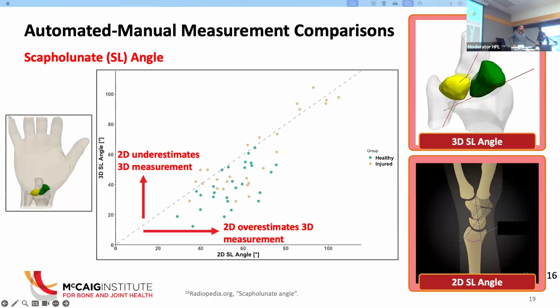So why would you validate in the cadaver model first and then move into this? I personally didn't do it, but there have been tests that have validated the contact area measurements between cadaveric and in vivo, whether in flexion extension or otherwise. In 2D and 3D? Just in 3D, yes. Those contact area measurements can only be done in 3D. Okay, and it's just as accurate? Yeah.